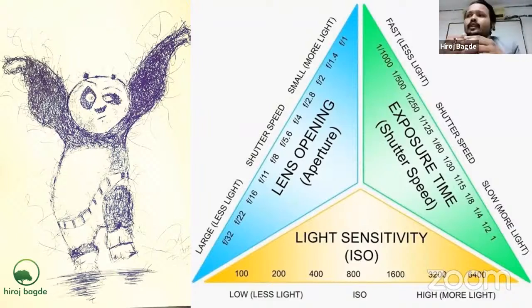So I cannot increase. If I increase, I will get more light. Definitely I'll get high sensitivity towards light, but I don't need that because I'm already using extra lights. Whenever you are practicing dental photography, you are in ambient light, because whenever the patient sits in the chair, or whenever we have some lights above the patient, that can hamper the image.